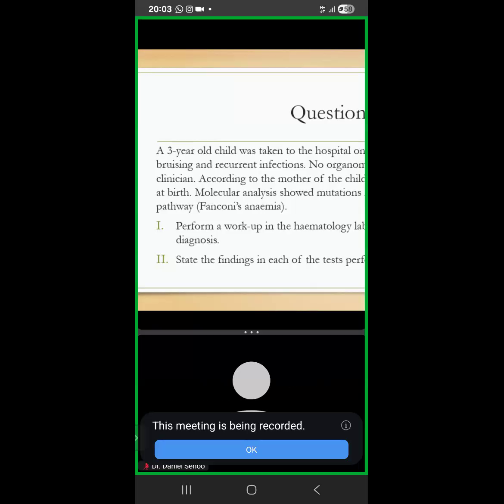As soon as our full blood count results are flagged, our next point of call will be to perform a peripheral blood smear according to the standard protocol, so that we don't create problems for ourselves. We are assuming that we are doing everything right. So we prepare and stain a peripheral blood smear. That will be the second test we want to do.